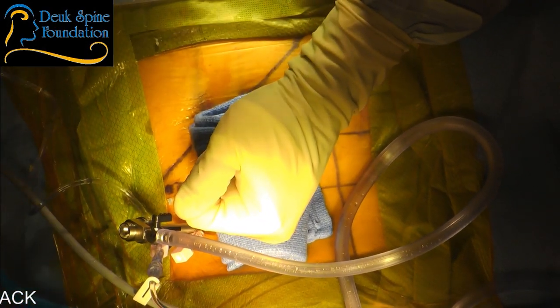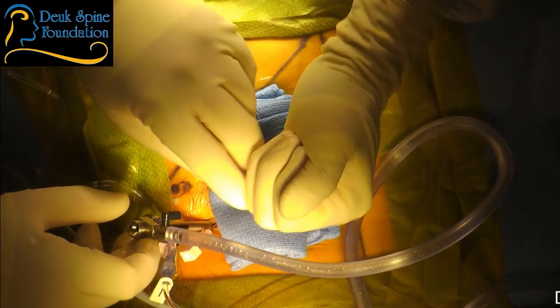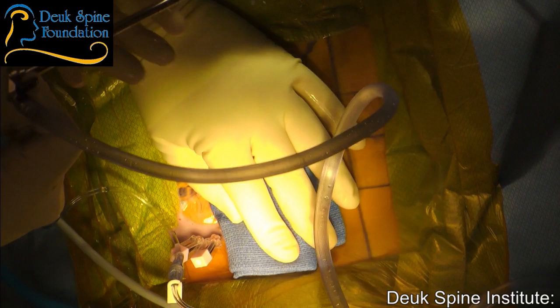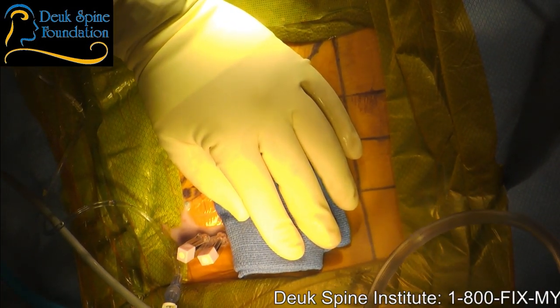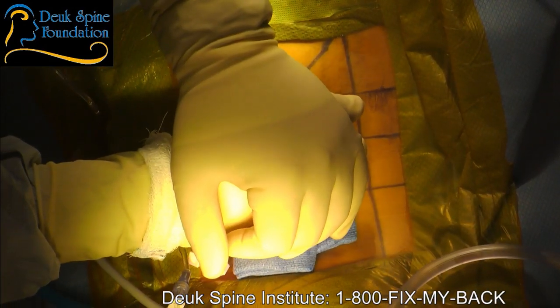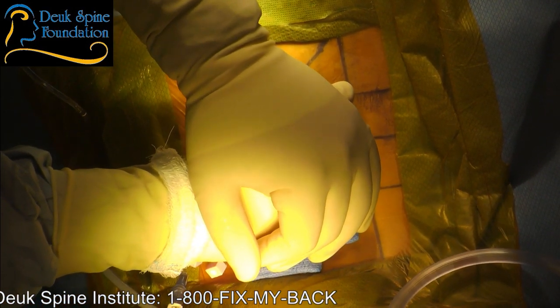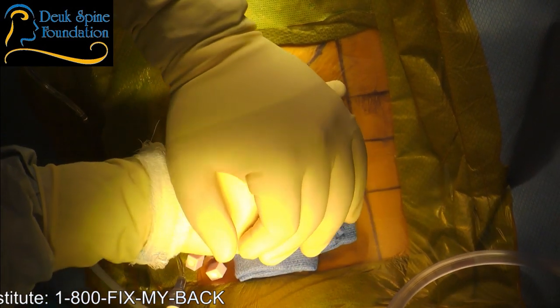That's a generalization. Okay, so we're done with the L3-4. We know that was a painful disc. We tested it with discography, and the patient had 9 out of 10 concordant pain. Concordant means it's his typical pain that he does get in his lower back. Discordant means we created a pain that they've never had before. So concordant, C-O-N-C-O-R-D-A-N-T, means pain that the patient typically experiences. So we're done with 1 out of 3.